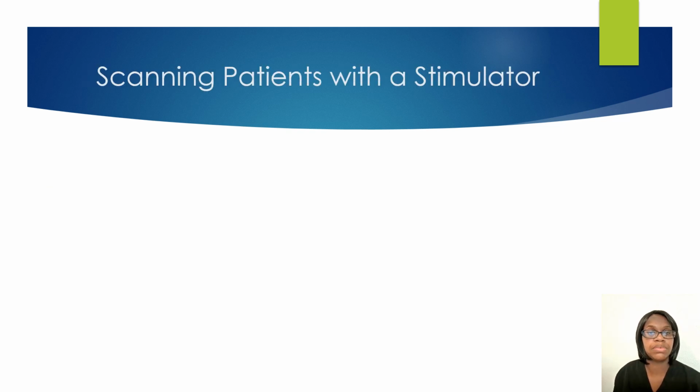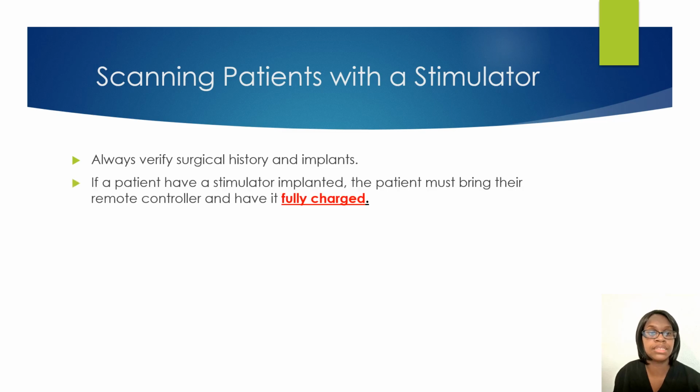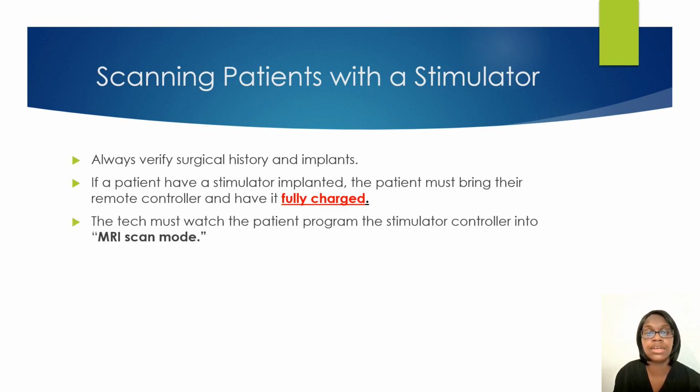Whenever you are scanning a patient with a stimulator, you always want to verify their surgical history and implants. If a patient does have a stimulator implanted, the patient must bring their remote controller and it has to be fully charged. You do not want the patient to put their stimulator into MRI mode at 4% and then it dies whenever they are inside of the MRI machine, and now their device is going to malfunction and there's no telling what can happen to the patient. So always make sure that they know to bring the remote controller and that it is fully charged.